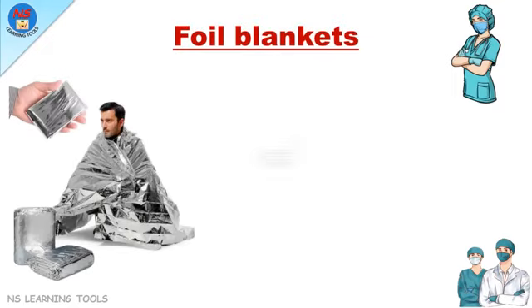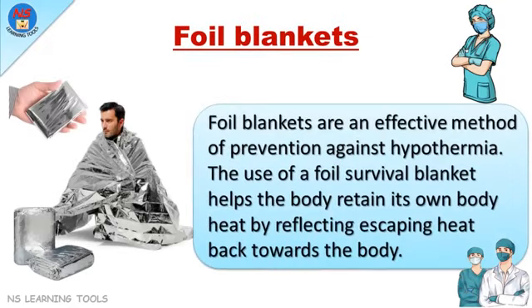Foil blankets. Foil blankets are an effective method of prevention against hypothermia. The use of a foil survival blanket helps the body retain its own body heat by reflecting escaping heat back towards the body.